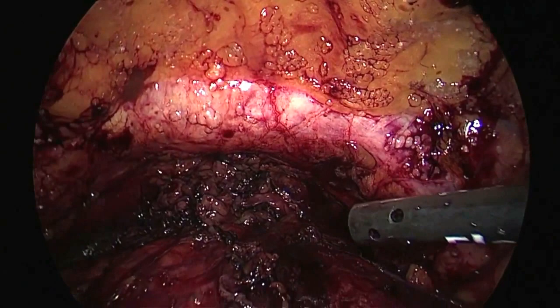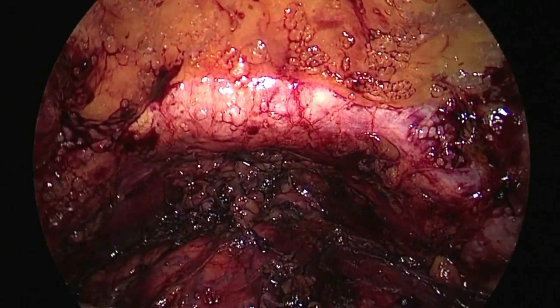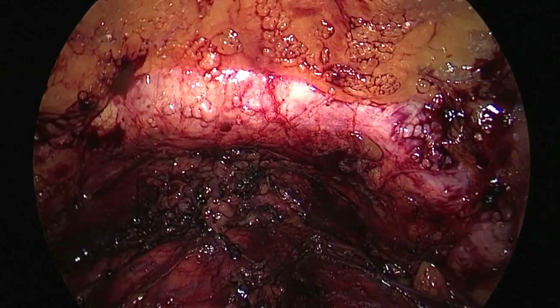Okay, I inflate the bladder now. The bladder is okay. Perfect. And now we can start with continuous lavage.